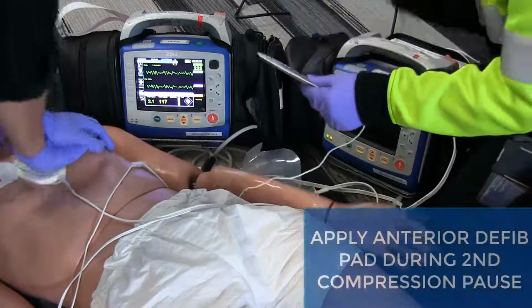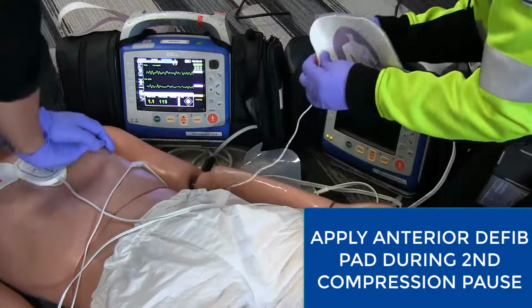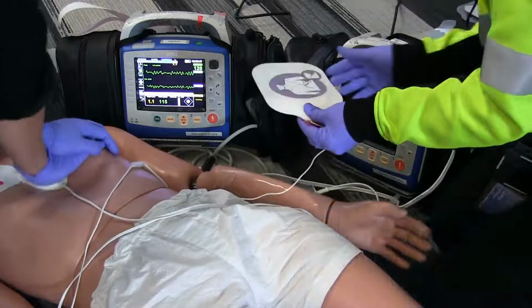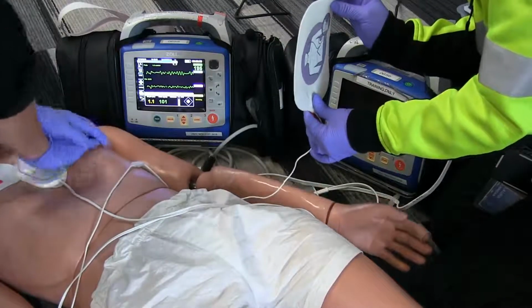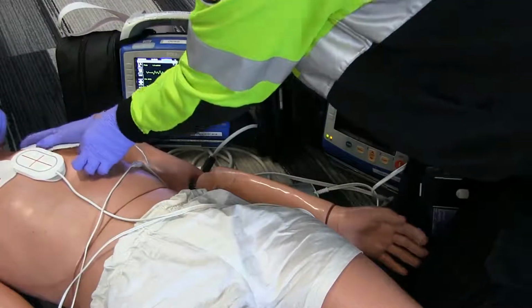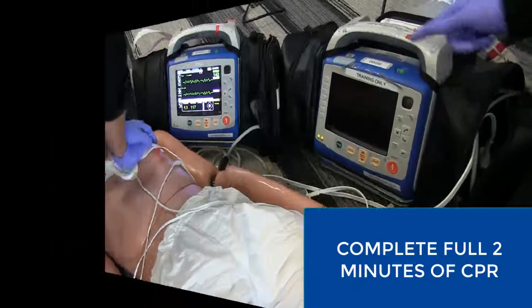Okay. After your next 30 compressions and two ventilations, we'll apply the anterior pad. Apply the anterior defib pad of the second monitor during the second compression pause. Complete the full 2-minute CPR cycle.